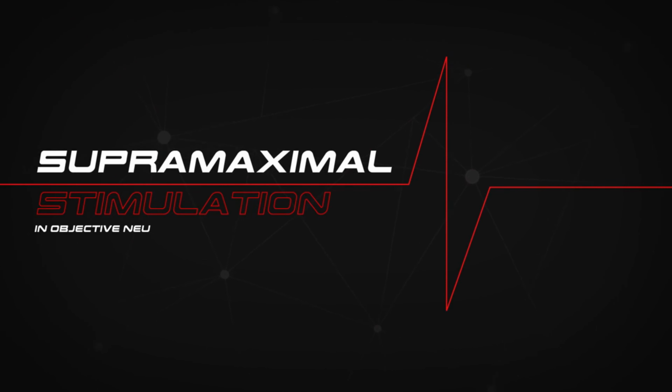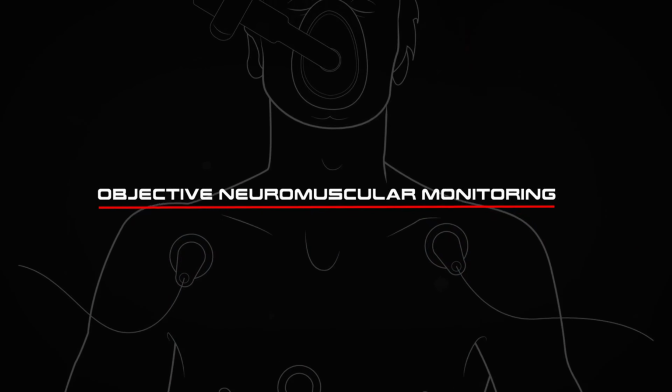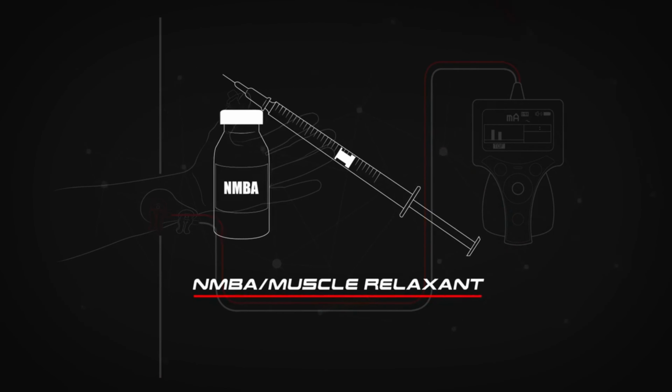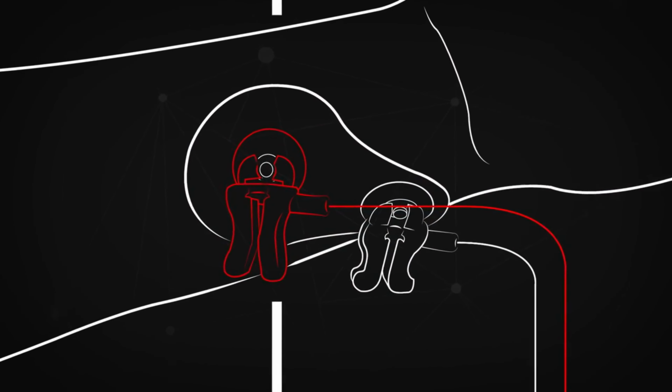Supramaximal stimulation in objective neuromuscular monitoring. Objective neuromuscular monitoring is a process whereby the intensity of a resulting muscle contraction is monitored with an electrical nerve stimulus to determine the efficiency of a neuromuscular blocking agent, or NMBA. In order to achieve a reliable result when doing objective neuromuscular monitoring, two primary pathways should be considered.